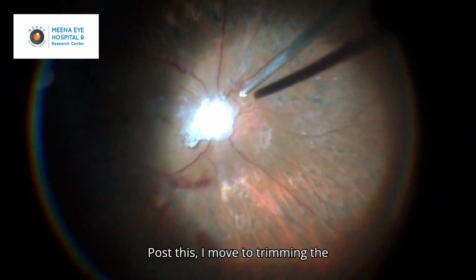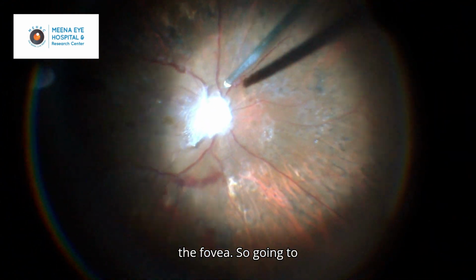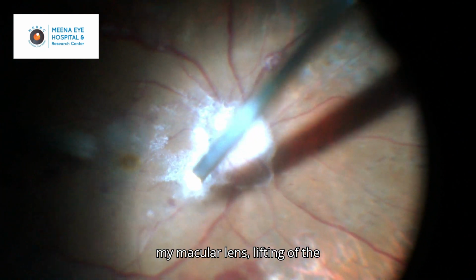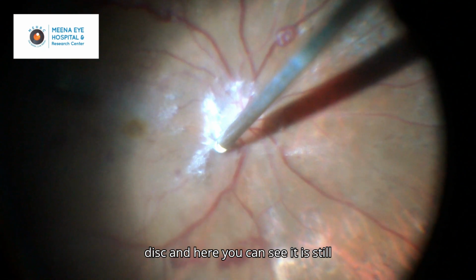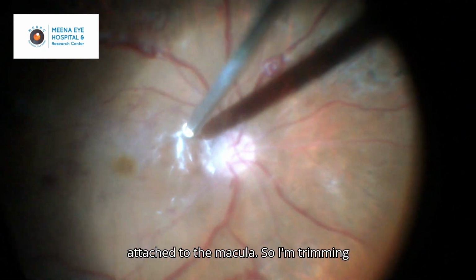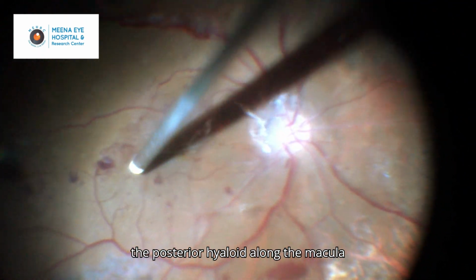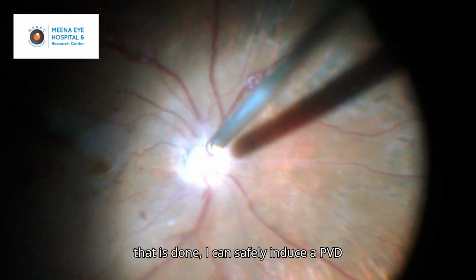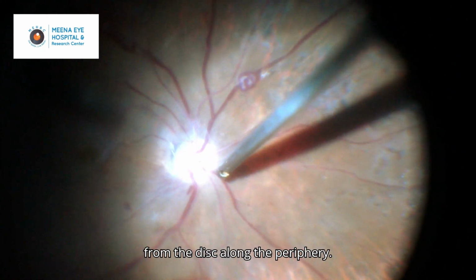Post this, I moved to trimming the vitreous along this central attachment at the fovea. So going to my macular lens, lifting of the posterior hyaloid from the disc, and here you can see it is still attached to the macula. So I am trimming the posterior hyaloid along the macula and keeping a frill at the center. Once that is done, I can safely induce the PVD from the disc along the periphery.